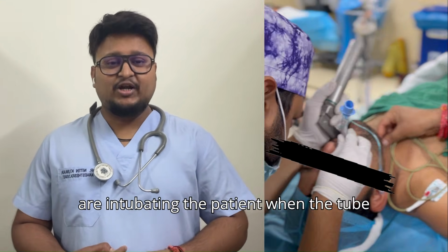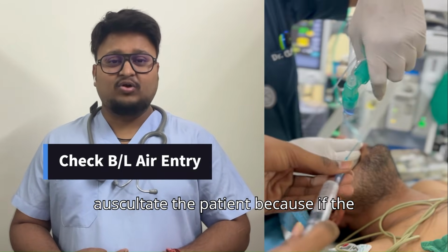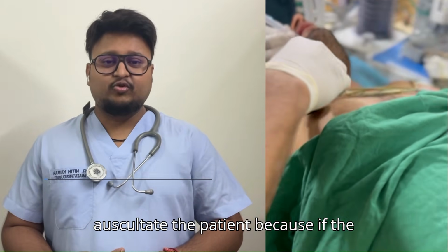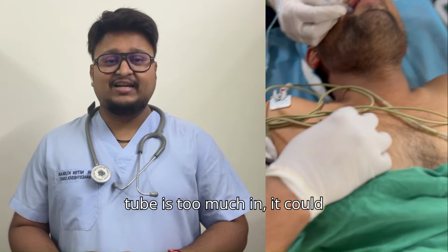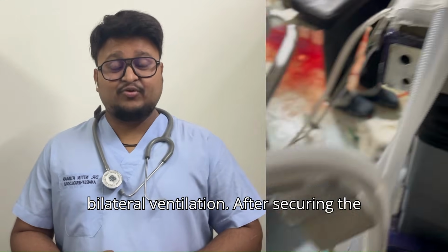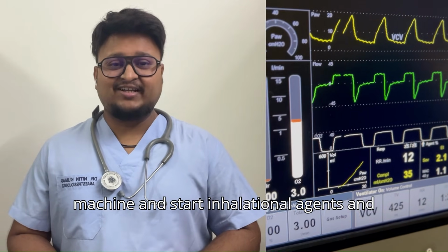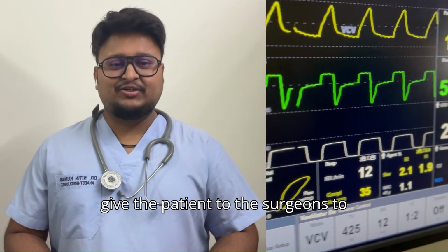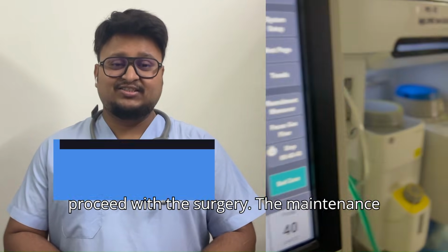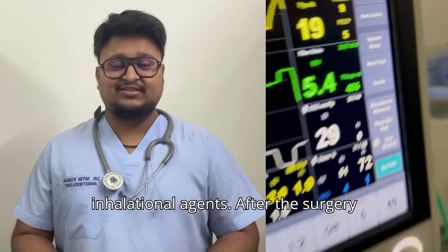Now you can see we are intubating the patient. When the tube is in the trachea, we bilateral auscultate the patient, because if the tube is too much in, it could only ventilate one lung. We need bilateral ventilation. After securing the tube, we put the patient on anesthesia machine and start inhalational agents and give the patient to the surgeons to proceed with the surgery. The maintenance of anesthesia during surgery is by inhalational agents.